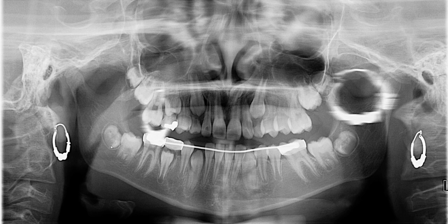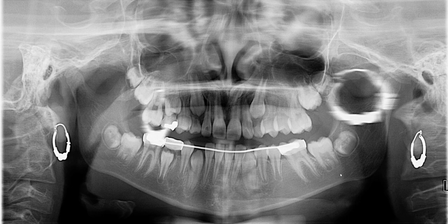Also, at this age, we're already starting to see the developing crowns of the third molars. Looking at the 12-year molar, we are at the middle stage of root development. It has formed beyond the bifurcation with wide-open APCs, and it's going to continue to grow quite a bit more. So we're at the middle stage — well short of age 12.